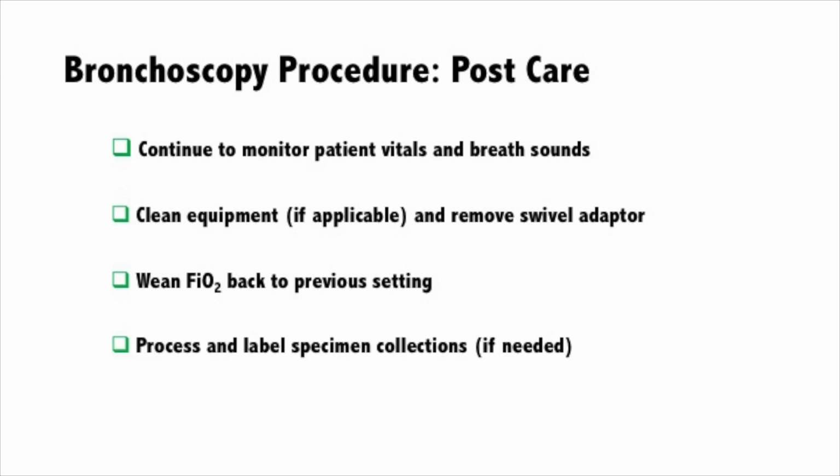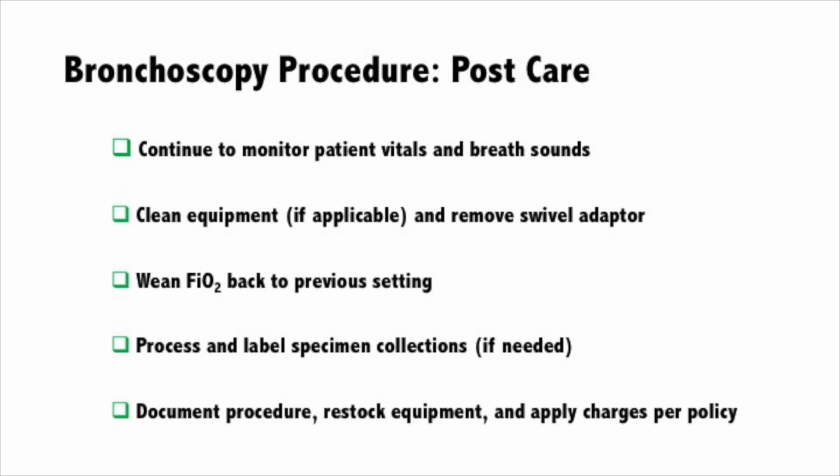You will need to process and label any specimens if they were collected during the procedure. You're going to want to chart the procedure, and then restock the equipment and apply any charges per hospital policy.